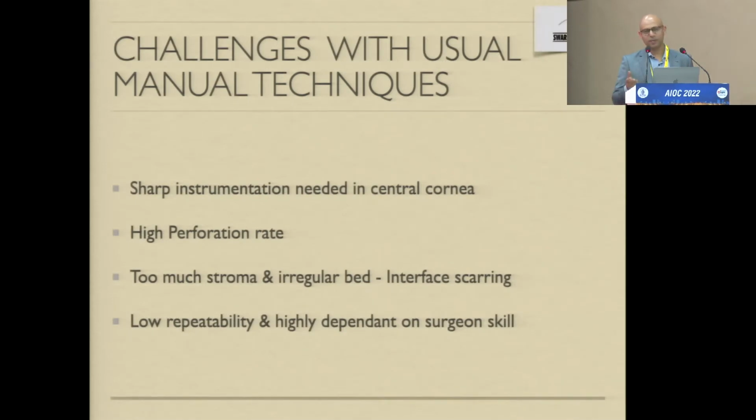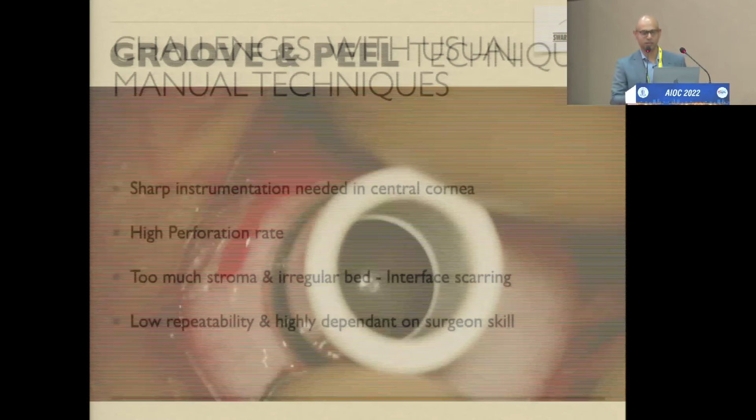Also, you'll end up leaving some stroma behind, so you'll have interface-related problems. So the challenges of the usual techniques are that sharp instrumentation can cause perforations, too much or an irregular stromal bed being left behind can cause scarring in the interface, and repeatability is low because the techniques are highly dependent on surgeon skill.